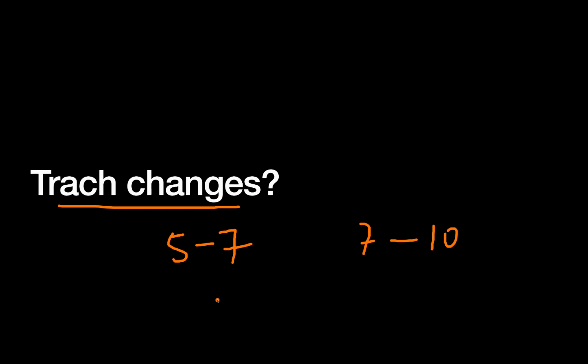It's important to always have a bougie. Again, that's just kind of a long rubber tube. To have a bougie available in case you make a false tract, or have a hard time getting that tracheostomy tube back in there when you change it. You can use that to make sure you get in the right space and then slide the tube over top of it. And then finally, decannulation.